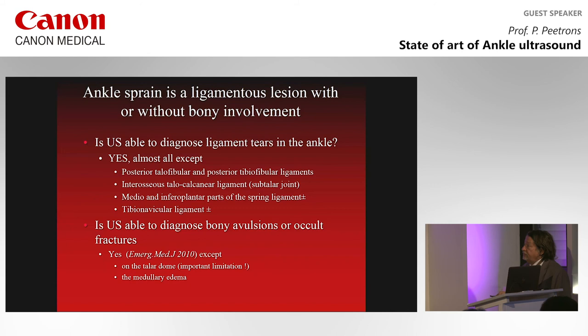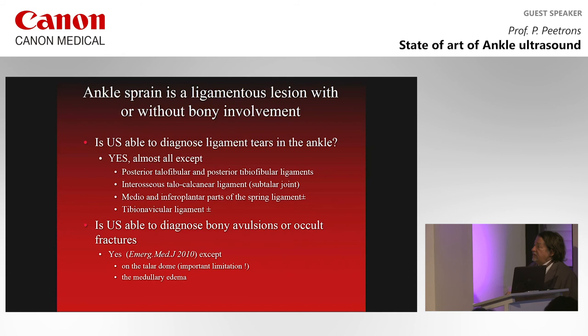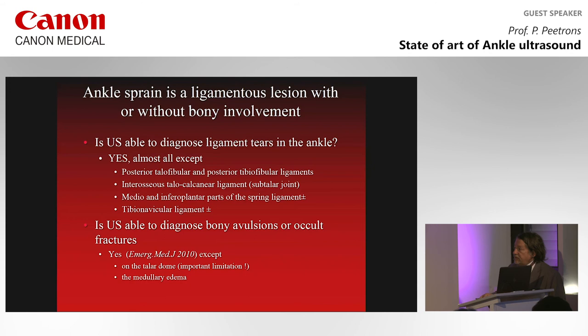So is ultrasound able to diagnose bony avulsions or fracture? Yes, this has been shown in another paper from Emergency Medicine Journal, except of the talar dome, and this is the most important limitation of ultrasound and the most important thing that you have to think about when an ankle sprain doesn't heal, still is painful after 3, 4, 6 weeks after the injury. So always think that we cannot see this, and this can be very important to have a diagnosis of this, and you must go to MRI in these cases.